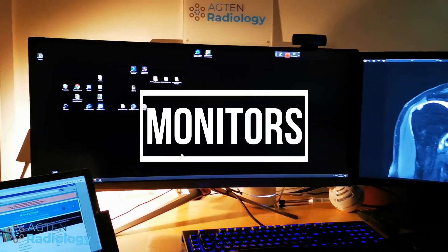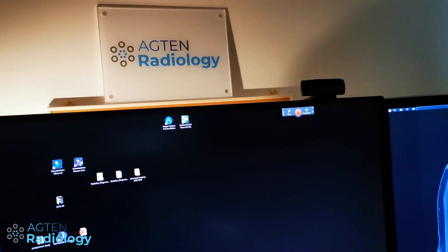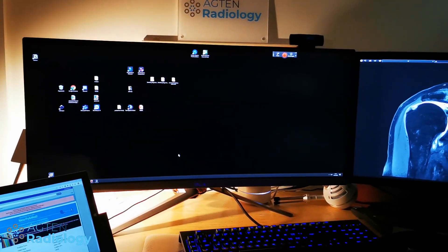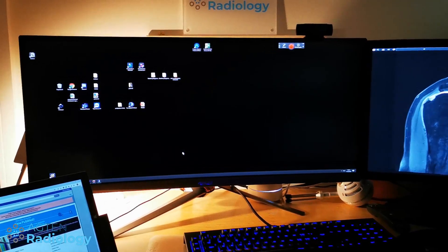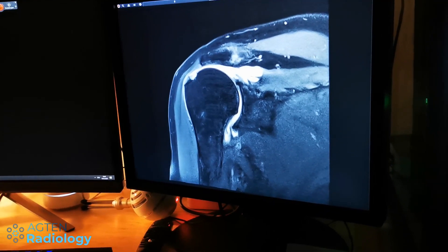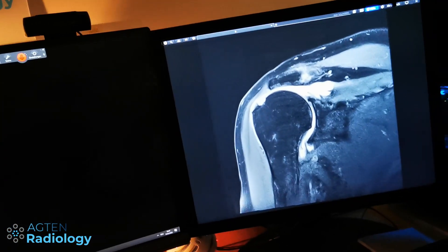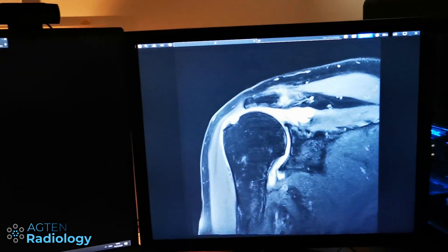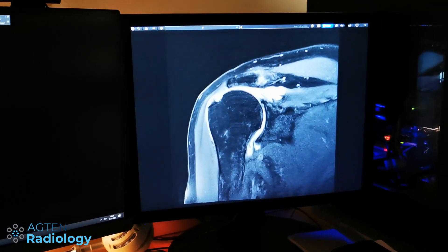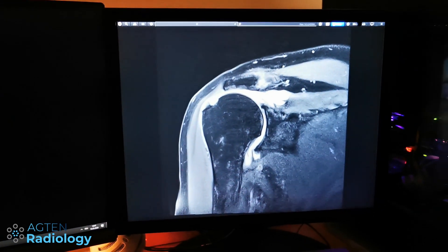Let's start with the monitors. This large one is a 34-inch, 21:9 format monitor. The diagnostic monitor is this smaller one — a Totoku 2-megapixel monitor, calibrated for DICOM images including chest x-rays, radiographs, CT, and MRI. I don't do mammography, which is why I don't need a higher-spec monitor.